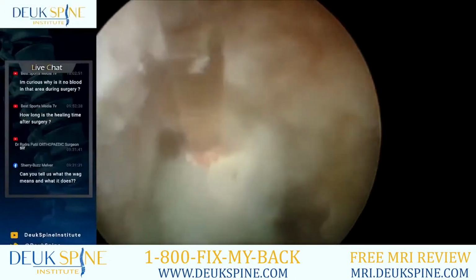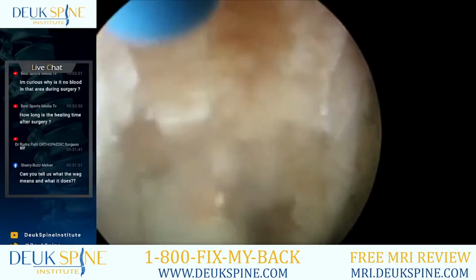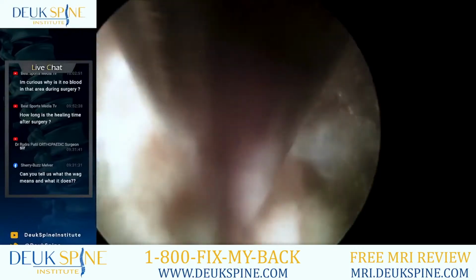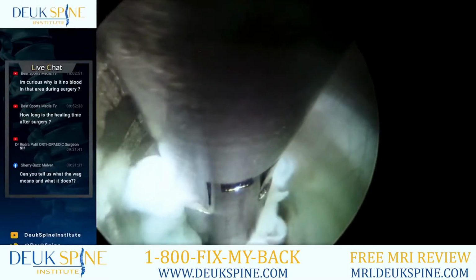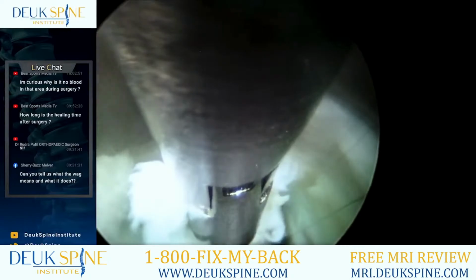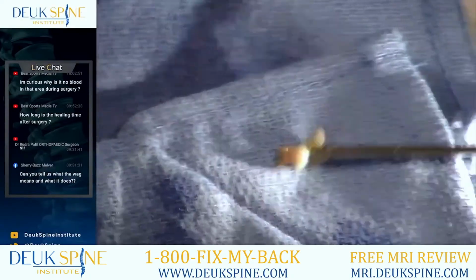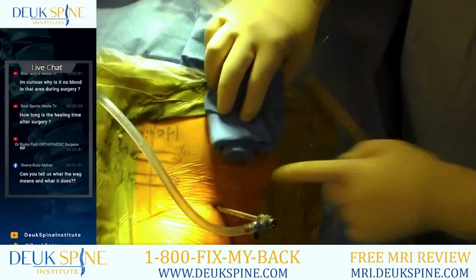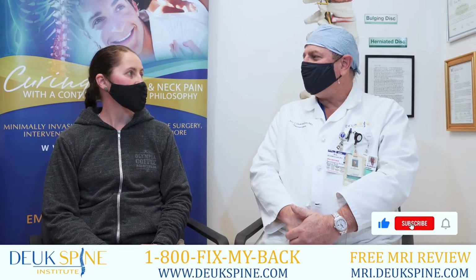Your surgery was a great one because we fixed 2 discs. You had herniated discs at L4-5 and L5-S1, and you can see in this footage that we grabbed the herniation out. One of the herniations was really big, and it was really gratifying to get it out because it was resting on your sciatic nerve. Once we took it out, I think your sciatic nerve probably felt a sigh of relief. Yes, absolutely. The surgery went very well. The laser debridement of the annulus went well, and I feel like your pain's going to be gone. It's not going to come back. I would agree.